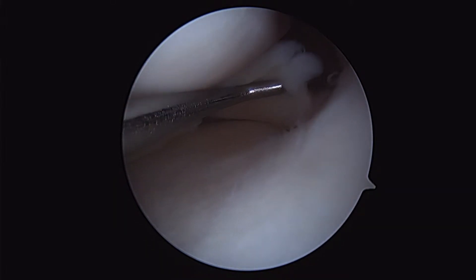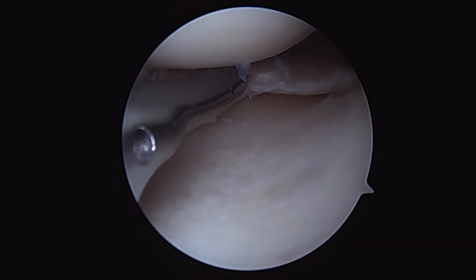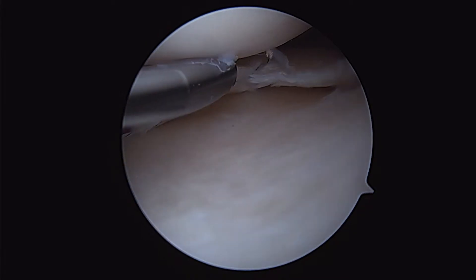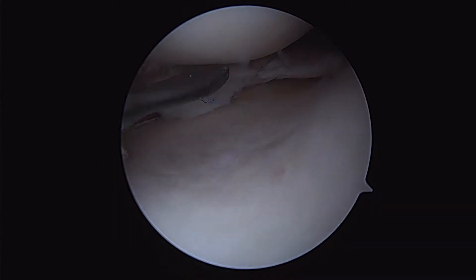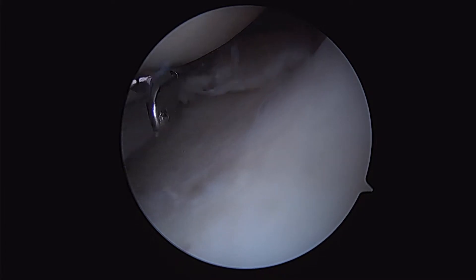This is a rip-stop technique for radial split tears of the meniscus. In this case we've got horizontal cleavage plane tears as well, so we're going to close these down with some vertical mattress sutures. We passed near the meniscal capsular junction, then we pass near the medial margin and we close down that split. Then we're going to use these as our rip-stop sutures.